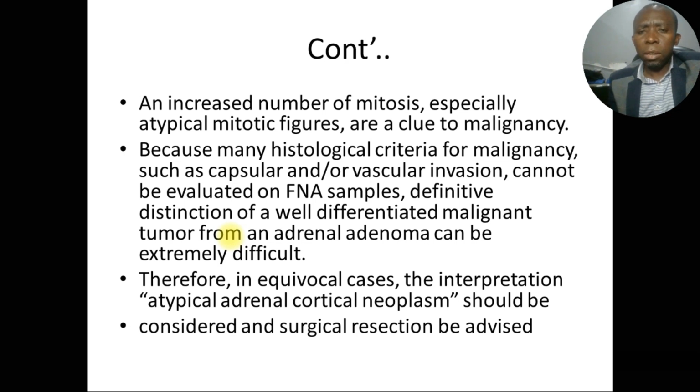can be extremely difficult. Given that in FNA we cannot really demonstrate the capsules, it is very hard to actually conclude.